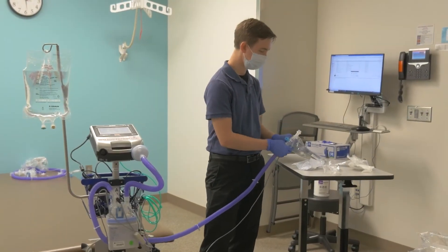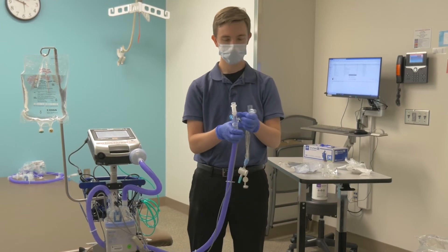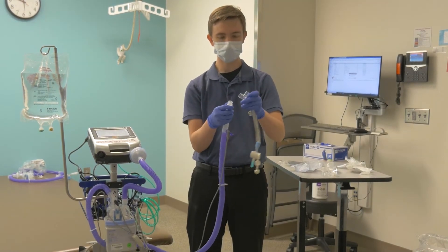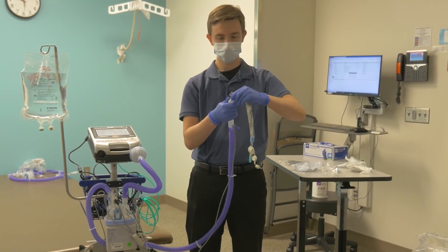Next, attach the OmniFlex tubing if approved by your doctor. The OmniFlex piece helps the circuit pull less on the tracheostomy tube and makes the circuit more flexible.